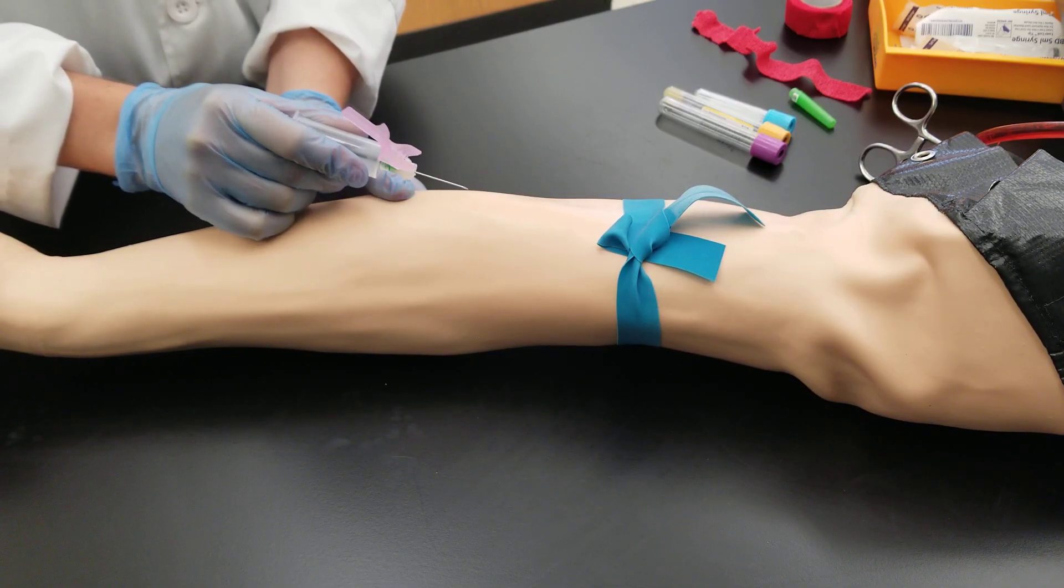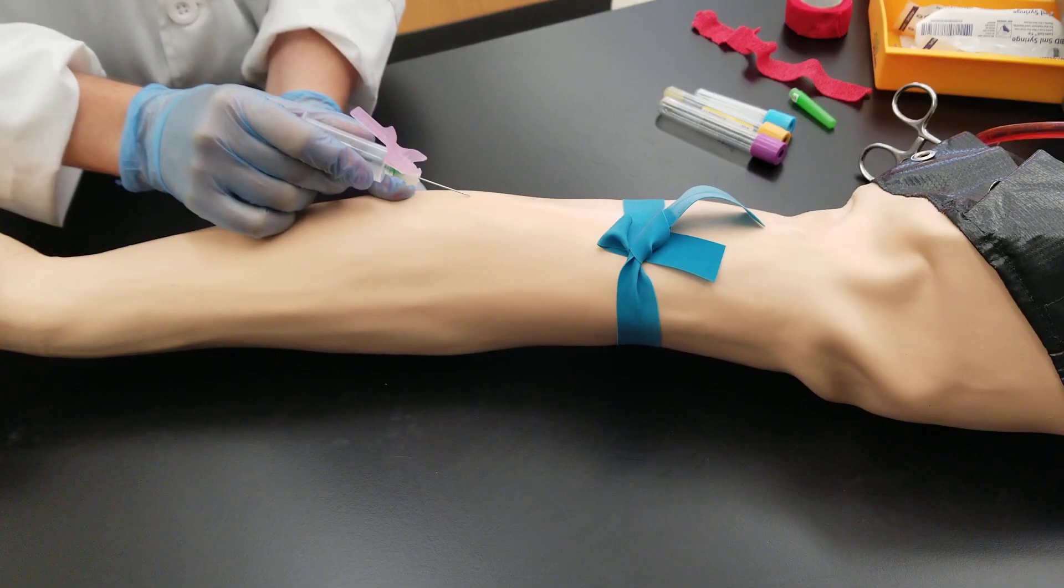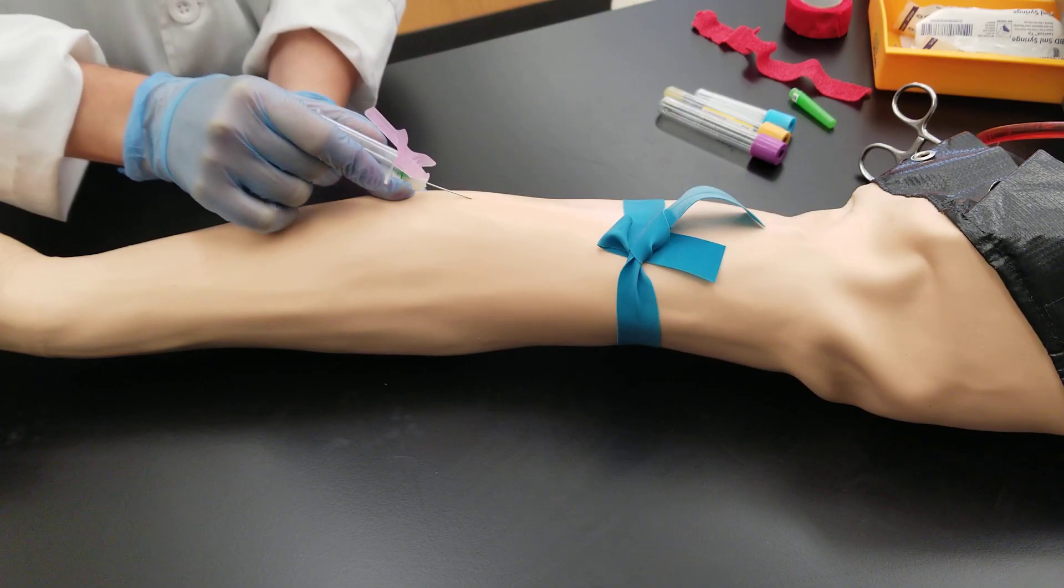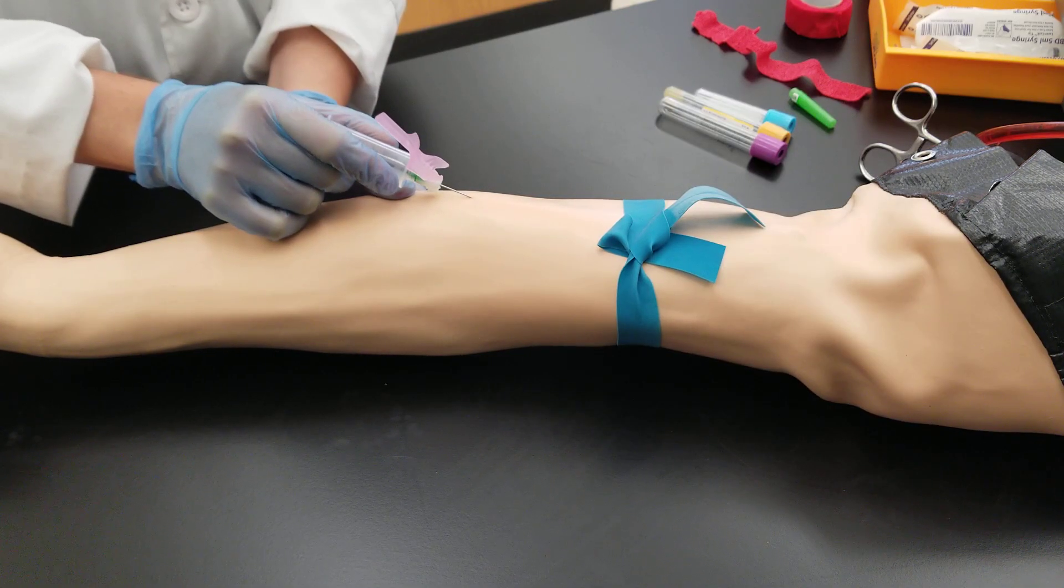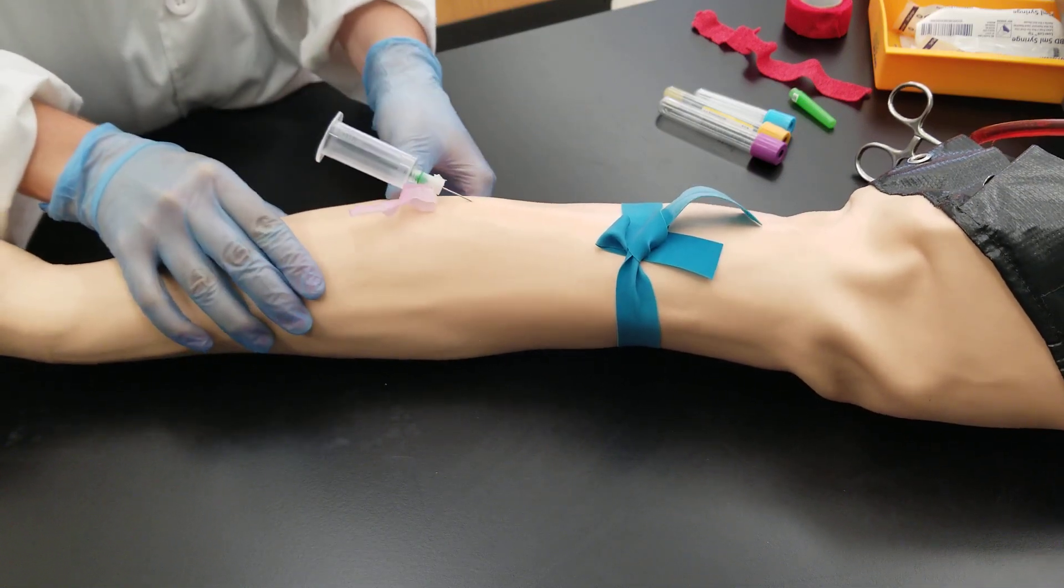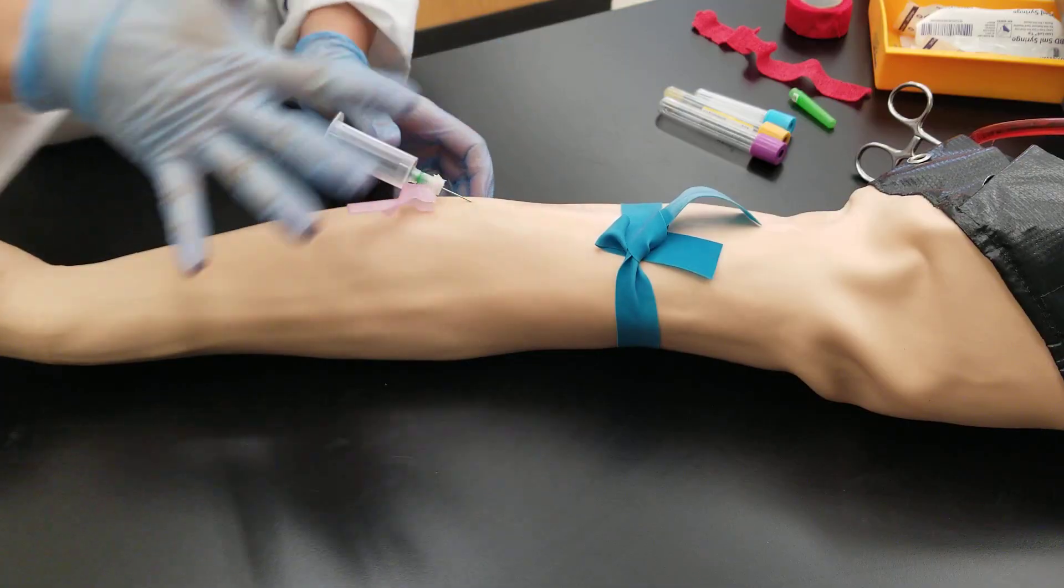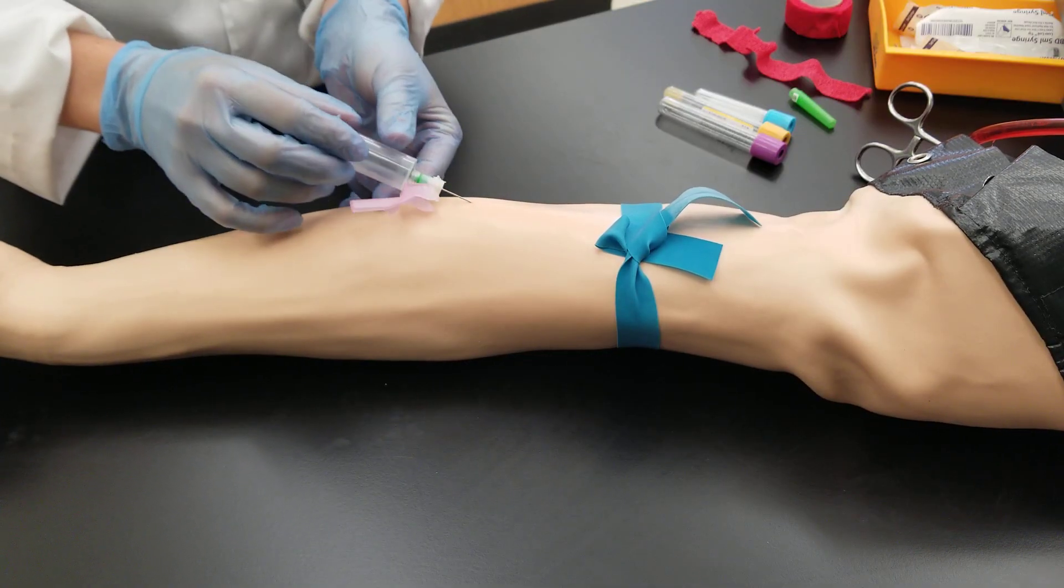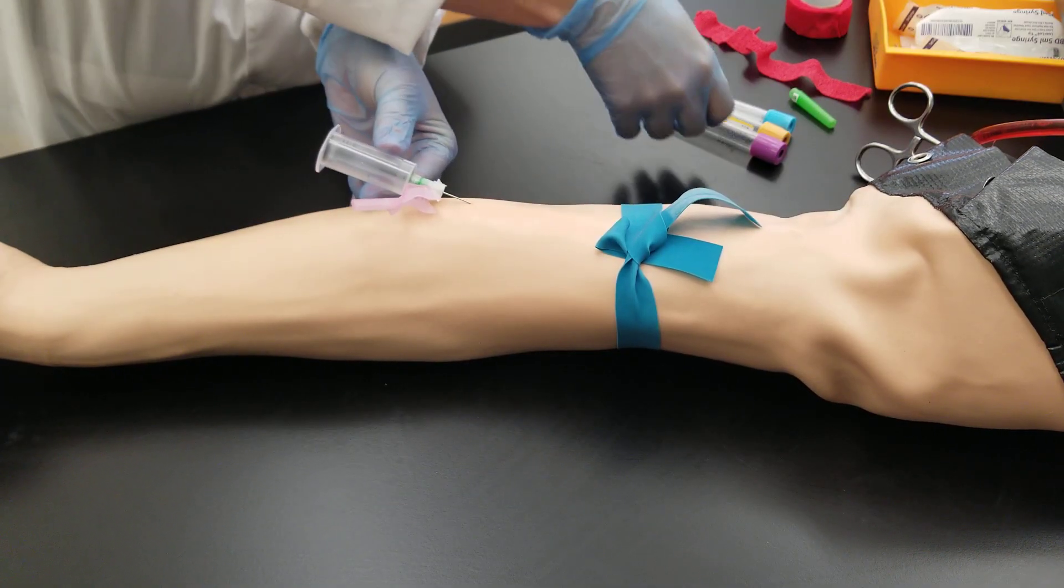So I'm going to then bevel up, gently insert the needle at a very low degree. This is a fake arm. So we have it in now.